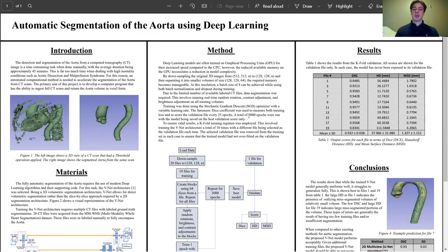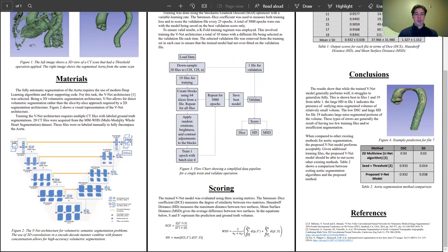All the data that I have comes from the multi-modality whole heart segmentation dataset. There are 20 CT scans of the chest and each one of those I labeled manually to locate the aorta and that's my training and validation dataset.